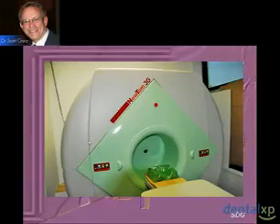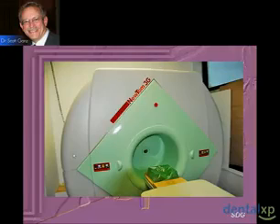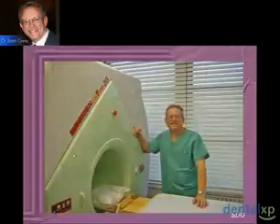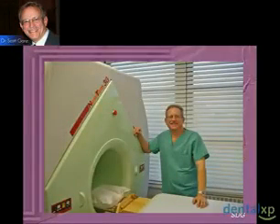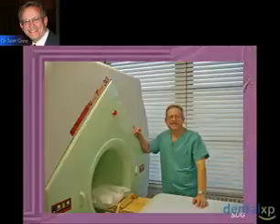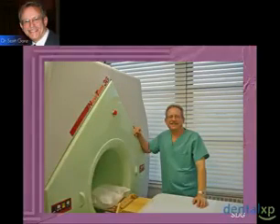This is an example of one of the cone beam CT scan machines — this happens to be the one that's in my office. Having this technology has taken away the barrier of having to send our patients out to a radiology center.